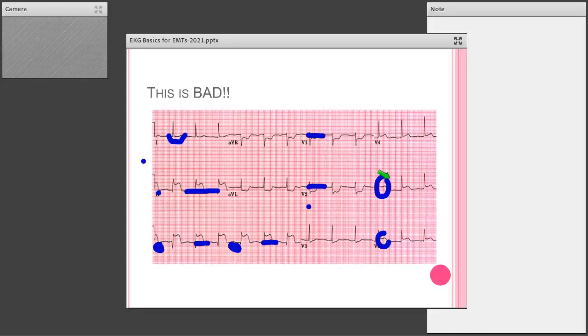And again, if you are transporting this patient because there isn't an ALS person available to you, hopefully you would be able to transmit this 12 lead to the hospital so they could start getting ready for this person who's coming in with a hot MI.